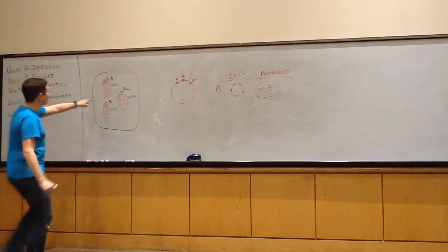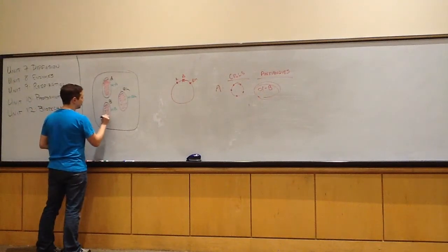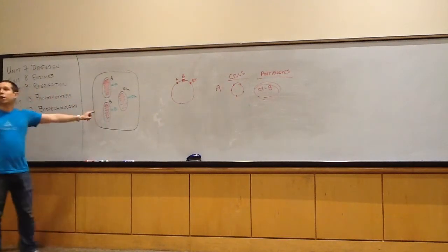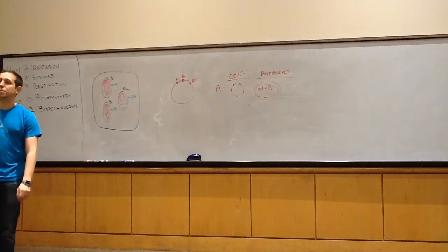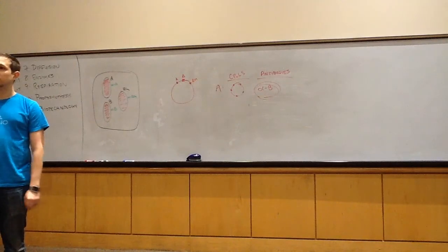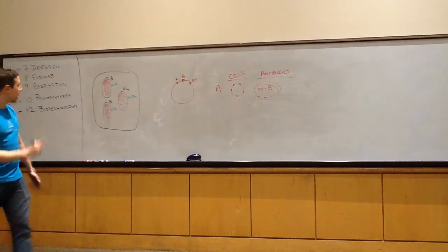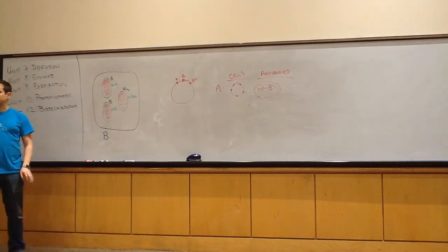So that person does not have A. But let's say here, I do see a reaction, where I see this agglutination. Okay? When I put their blood into this B well that has antibodies against B, what is that telling us? What carbohydrate do they have on their red blood cells? They have B. And we would classify this person as having B-type blood.